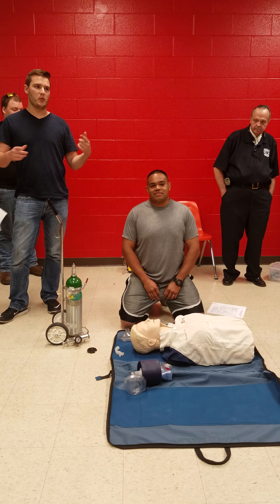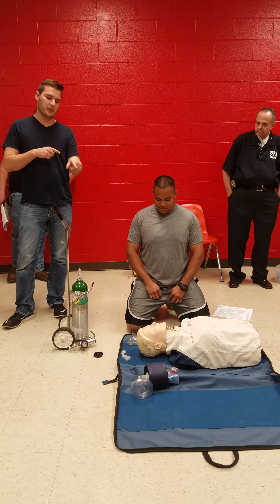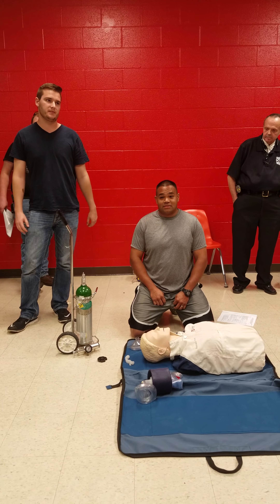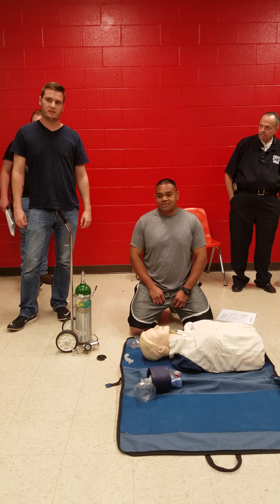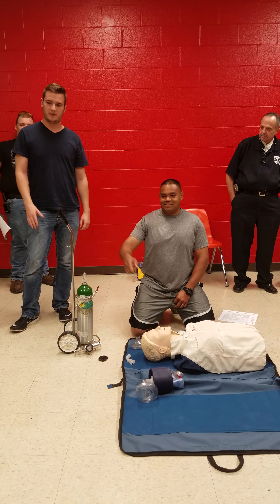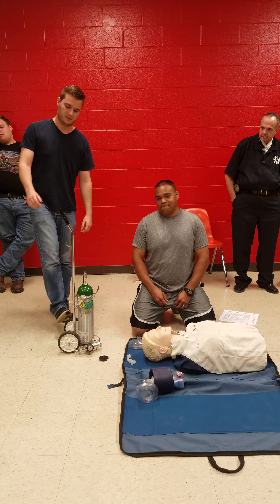Do you guys know and remember why the barrier mask is 16% and why the bag valve mask is 21%? Exhaled air versus ambient.